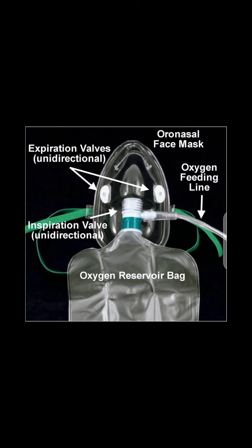I hope that is very clear. There's no confusion about it. It is as simple as I have just explained it. So it is important that we note this and also ensure that the mask is fitly attached to the patient's face to avoid any escape of oxygen into the atmosphere.